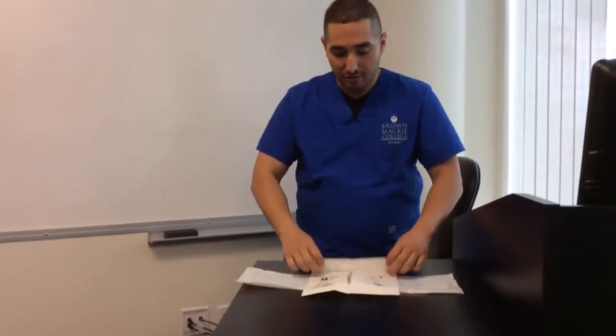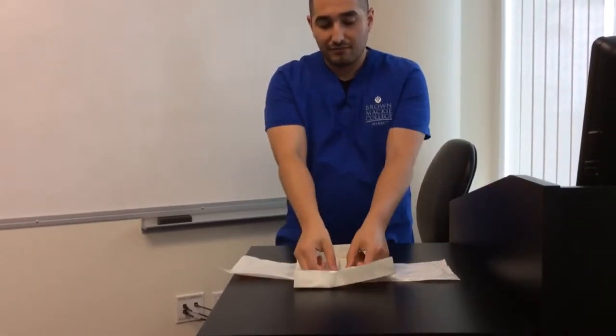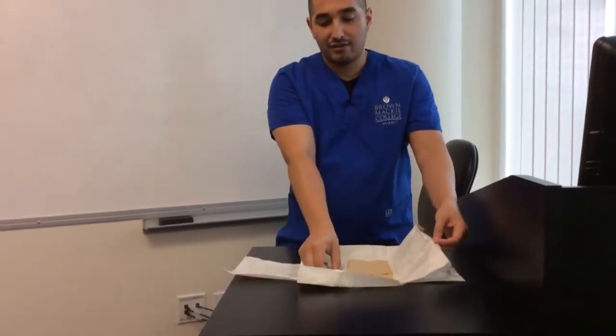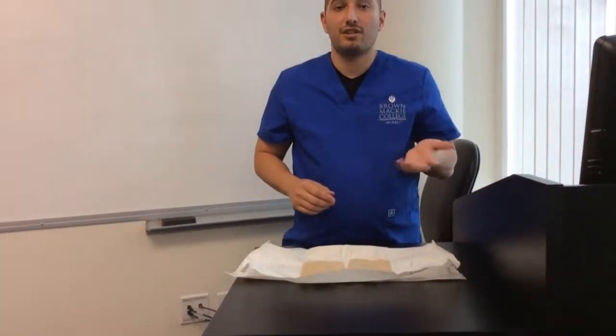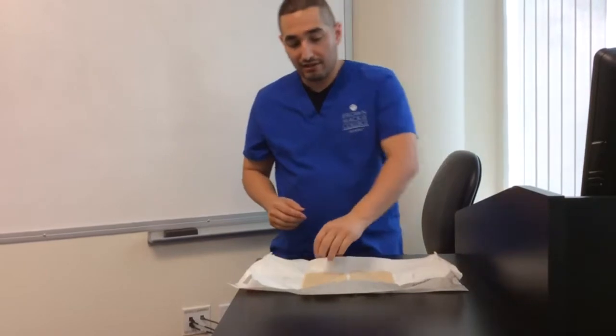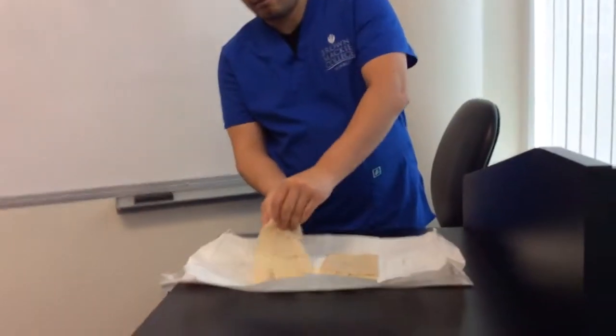Okay, and you're probably going to start opening up softly, making sure to open the package completely without touching the inside of the sterile field inside the gloves. Then you can use your non-dominant hand to grab the inside of the cuff with your thumb and your index fingers, and then you're going to use it to put it on your dominant hand.